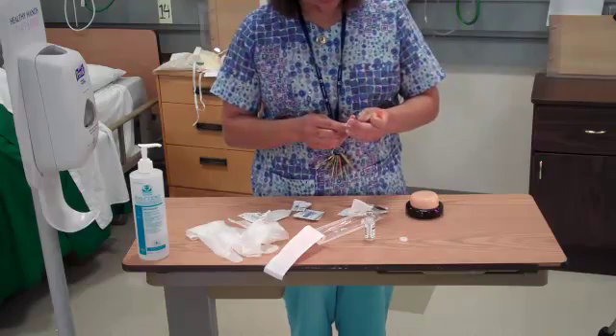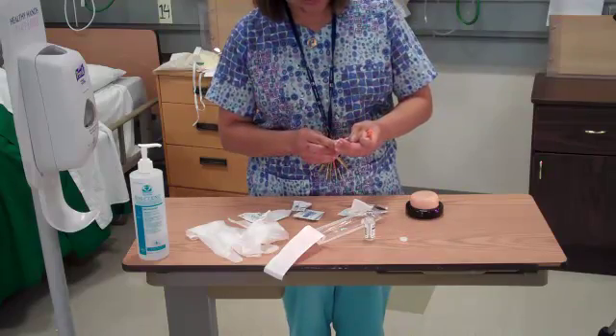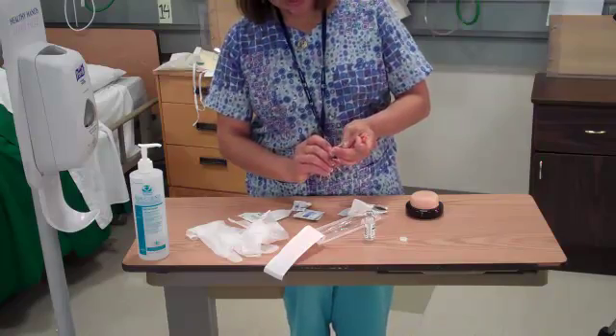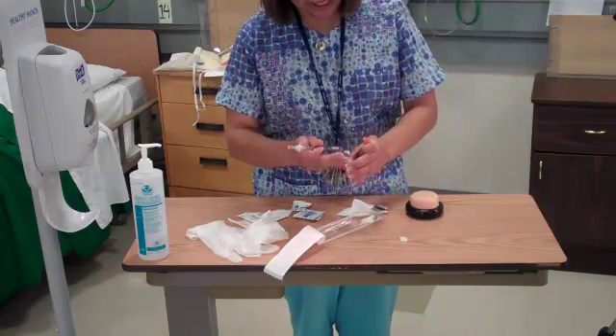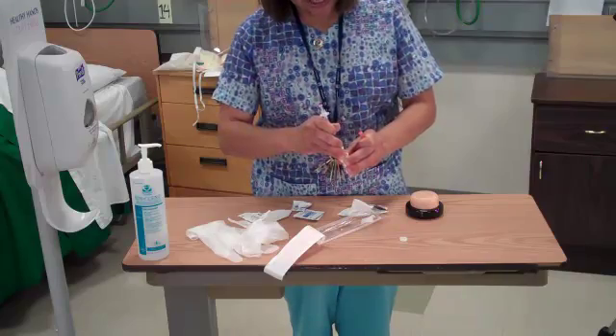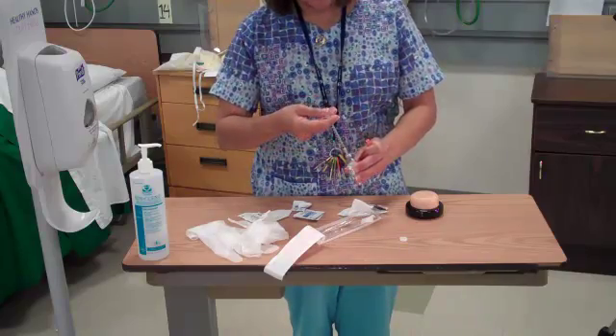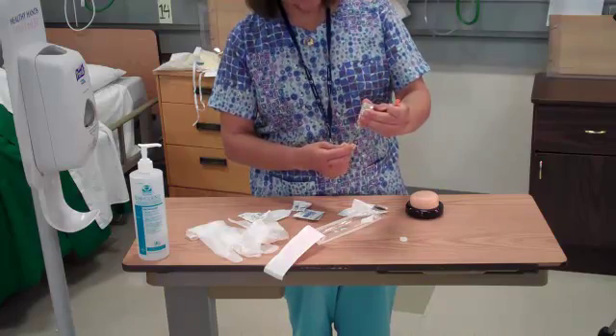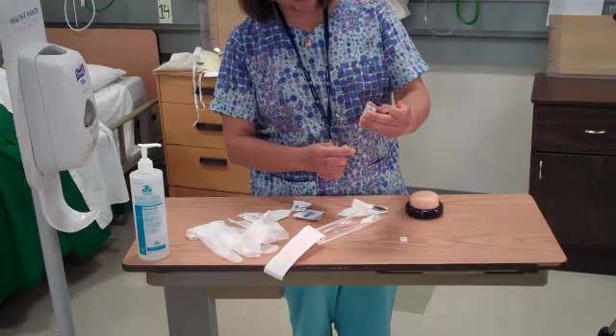Pull back to 20 units because that's the same amount of medication that I'm going to give. I have 20 units of air that I will inject into the middle of the vial, straight down, inject the air, invert the vial, and aspirate the medication.